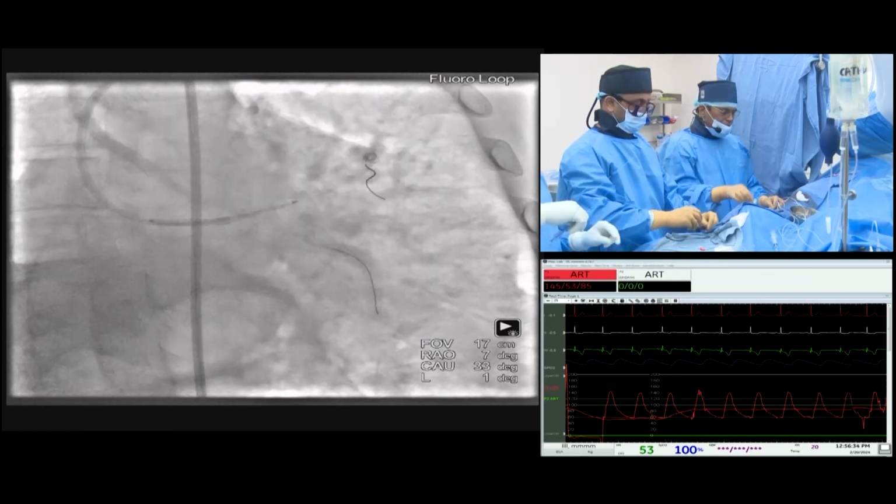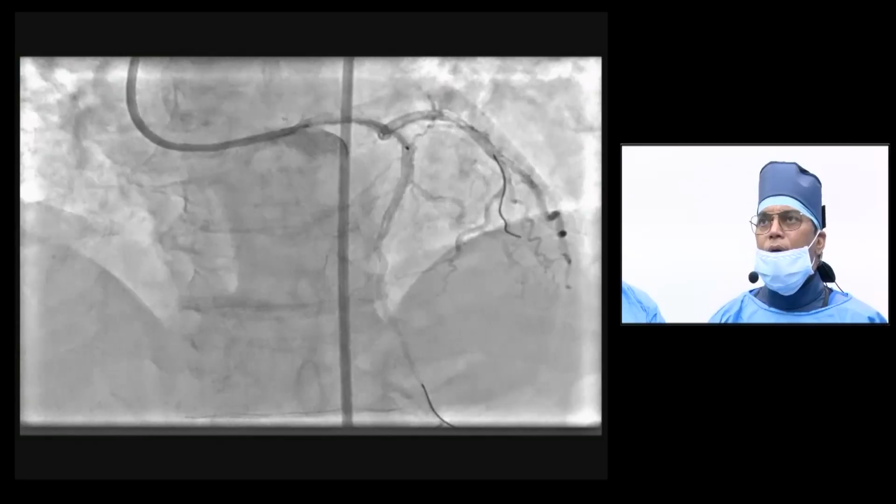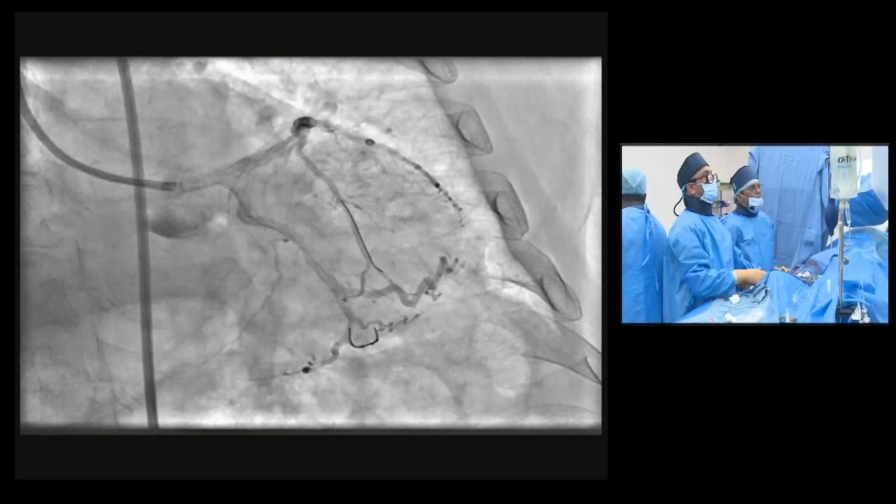So we'll try, maybe because of the bias, the previous stents might be disturbing this one. I think it's covered. Go ahead. Implant, deflate. Good, flowing well.